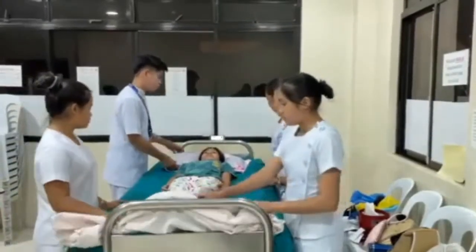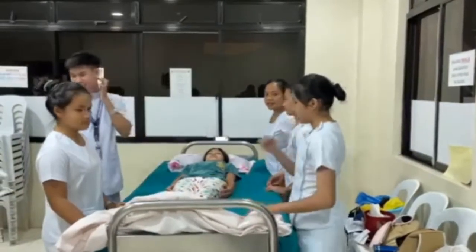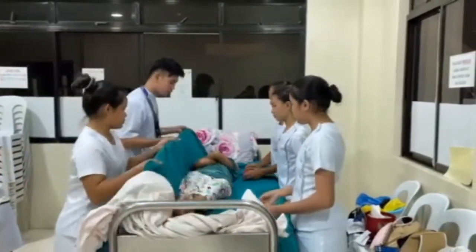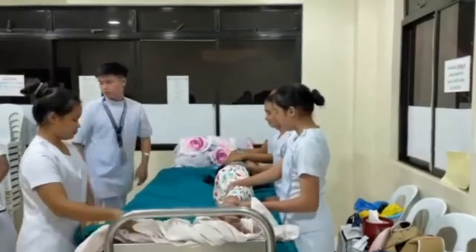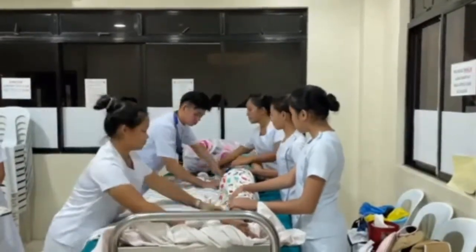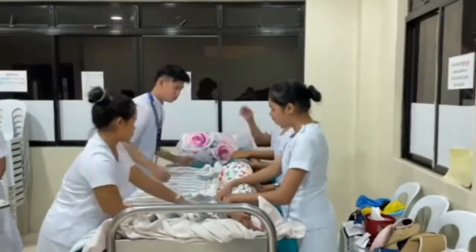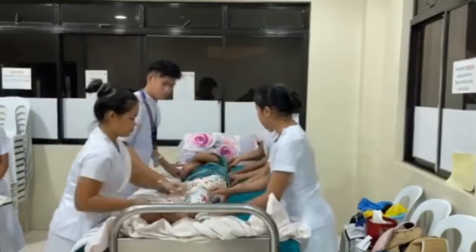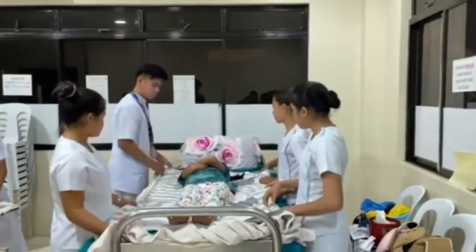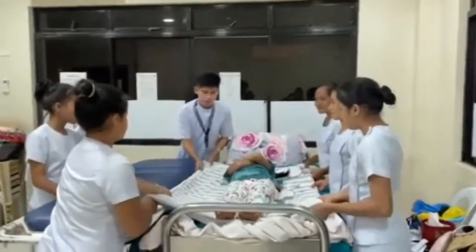Step 2. Transfer the client securely. If the client can transfer independently, encourage him or her to do so and stand by for safety. If the client is partially able or not able to transfer, one caregiver needs to be at the side of the client's bed, between the client's shoulder and hip. The second and third caregivers should be at the side of the stretcher, one positioned between the client's shoulder and hip, and the other between the client's hip and lower legs.